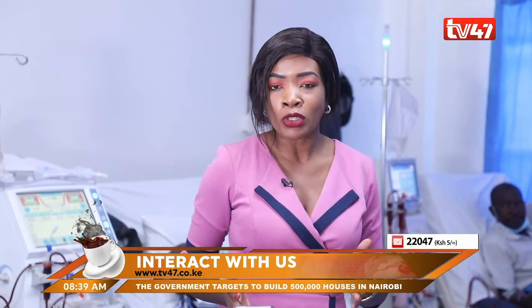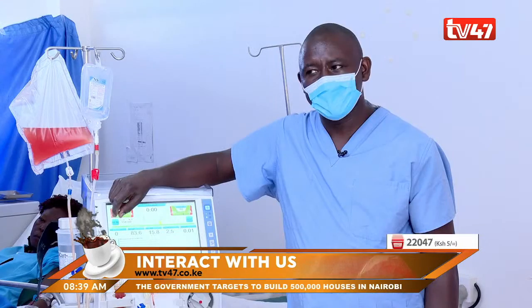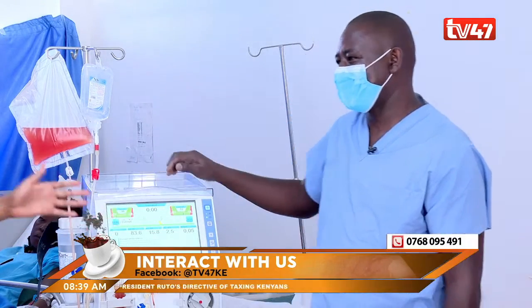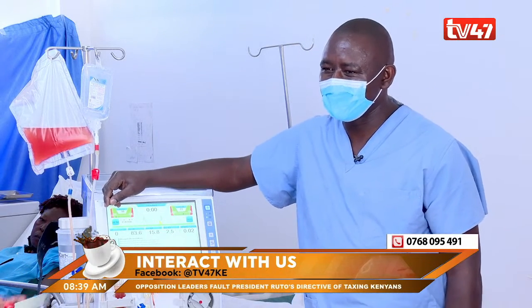That means there's some element of success in this. You march into this room and there's so much life — the patients are happy, they're enjoying their meals, because hope has been sold to them. So we just get to understand how important the dialysis process is. Dr. Ali, I am coming to you — I know this is the dialysis machine. Tell us exactly what is the dialysis process in layman's language.